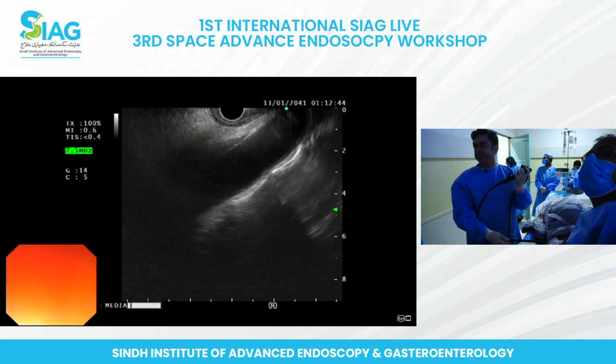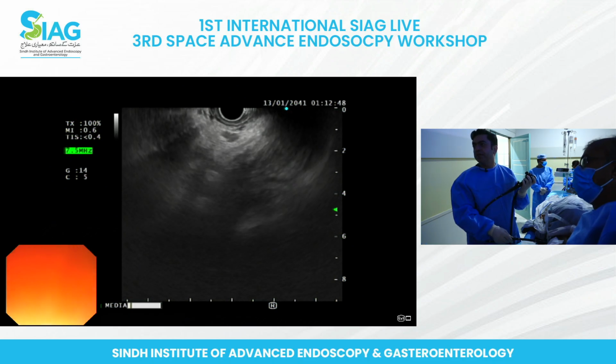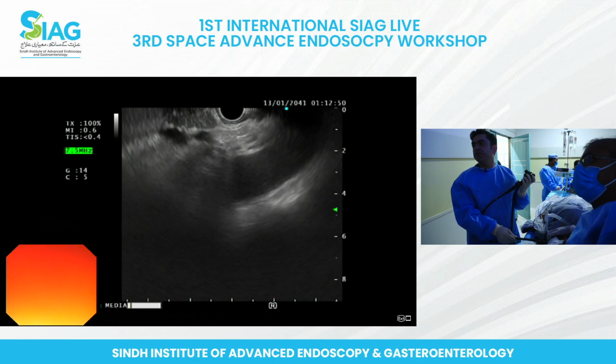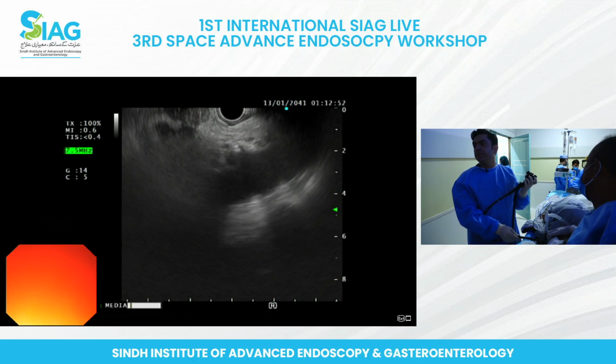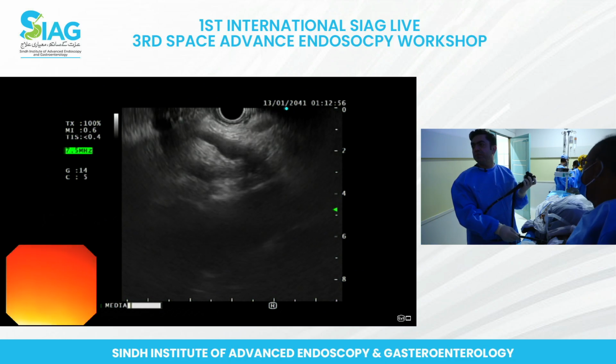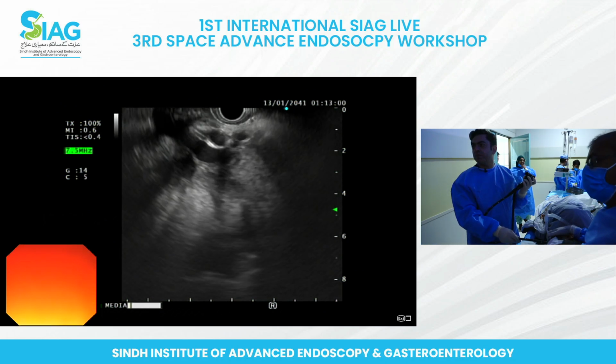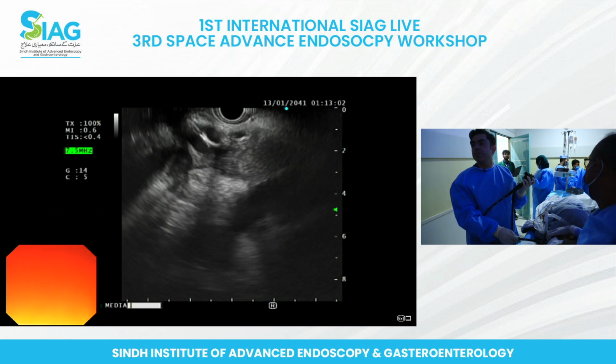So this patient was referred to us only 2 days ago. Patient was symptomatic, has had Whipples and also in fact left Hemi, has been referred by the surgical department with this previous CT. So currently there doesn't seem to be a collection there.